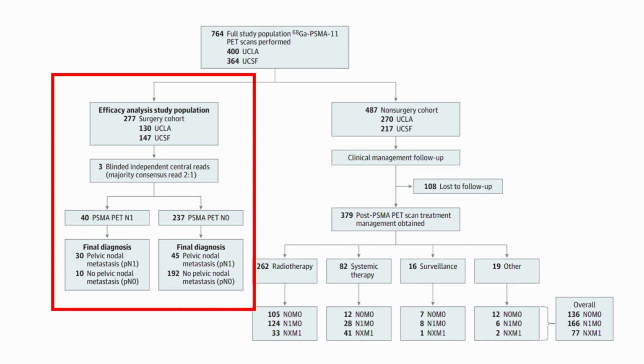And the primary outcome of this was the detection of pelvic nodal disease, which was noted in about 40 patients based on PSMA PET, or 14%. And so, unlike the PRO-PSMA trial, all patients in this study underwent radical prostatectomy with pathology as the gold standard.